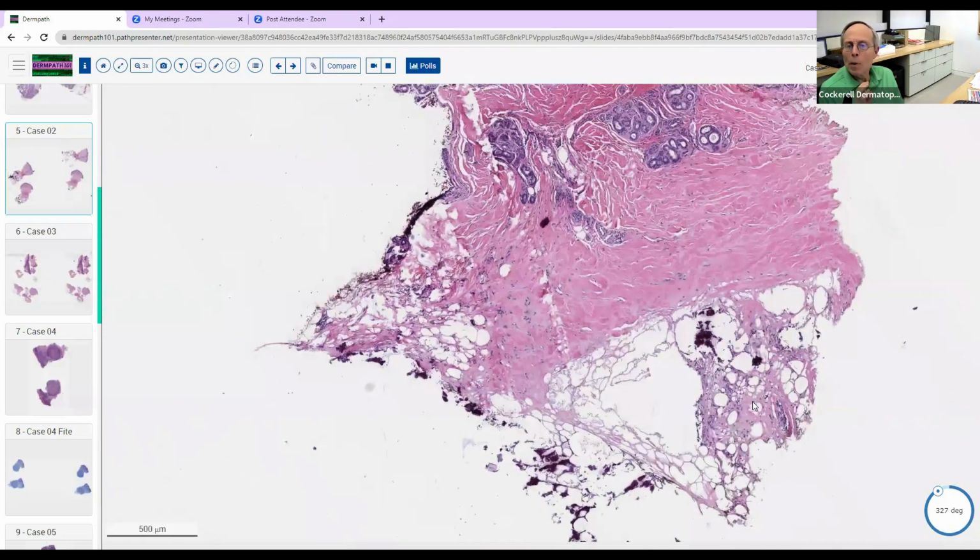Yeah, good. You get thrombosis of the blood vessels. And the reason that those patients really get super sick and often die is because they get a thrombotic vasculopathy. They get calcification of the blood vessels, they get secondary protein C and S deficiency, and then basically thrombotic vasculopathy that leads to infarcts and MIs and strokes and all that other nasty stuff. And there's really none of that here, is there? There's just mainly this dermal sclerosis in the lower part of the fat with this fat degeneration.